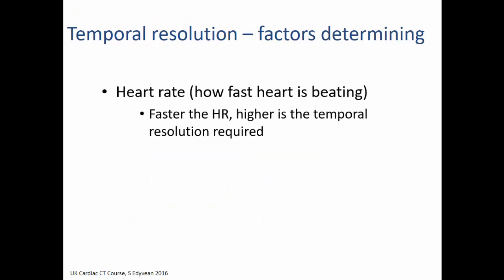And what determines that is the heart rate, how fast the heart is beating. And the faster the heart rate, the quicker your shutter speed needs to be to image that heart.